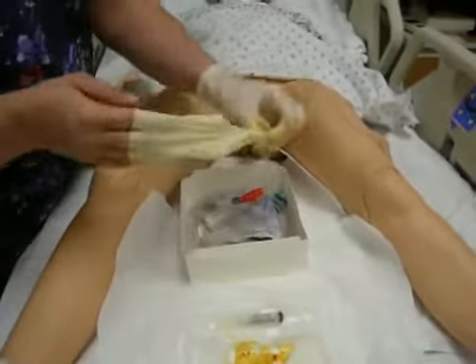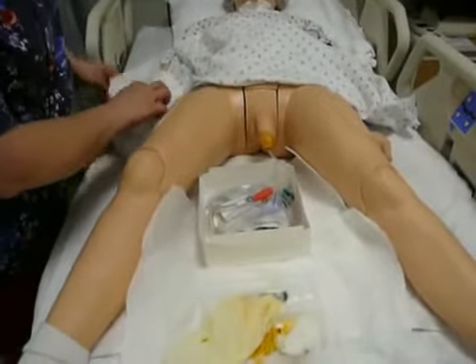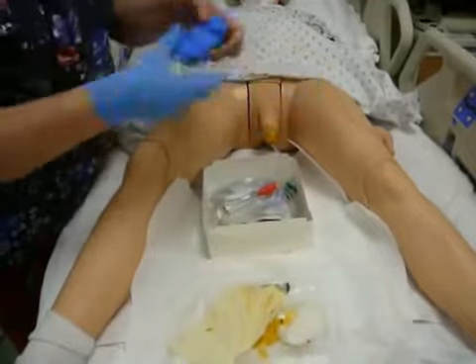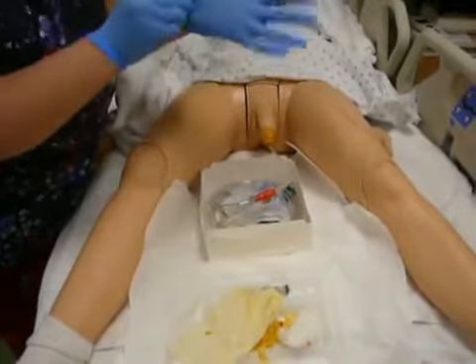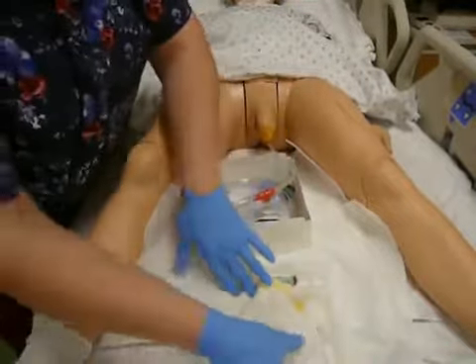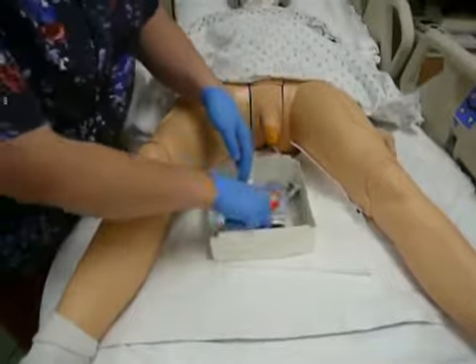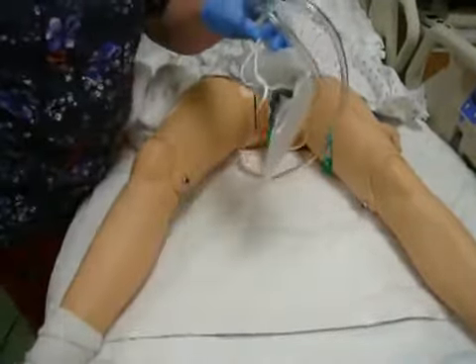Now I'm going to transition from sterile gloves to clean gloves. So I'm going to grab my clean gloves that I have right next to me here. After I get these on, I'm going to clean up my garbage, secure the catheter to him, and then clean him off. So first I clean up my garbage. Take the catheter out of here. Take that box, that sterile drape.